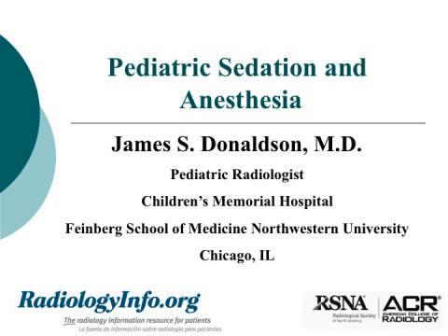Hello, I'm Jim Donaldson, a pediatric radiologist from Children's Memorial Hospital in Chicago, Illinois. Some radiology examinations require that a child hold very still and sometimes hold their breath to eliminate motion during a diagnostic examination or procedure. Sedation may be necessary in young children who cannot cooperate on their own.